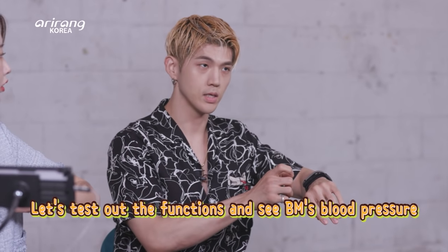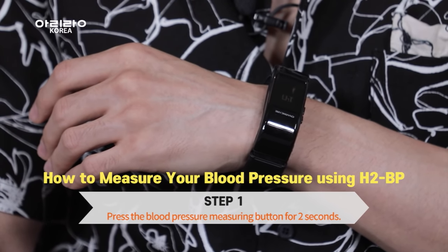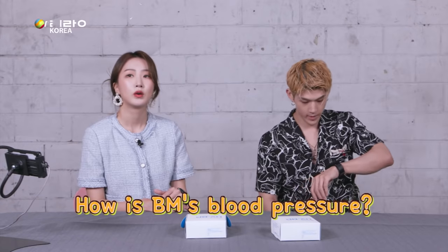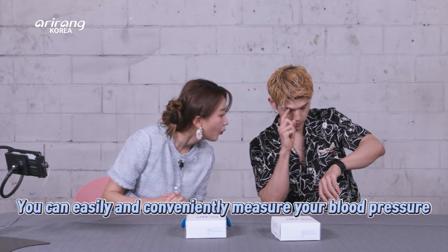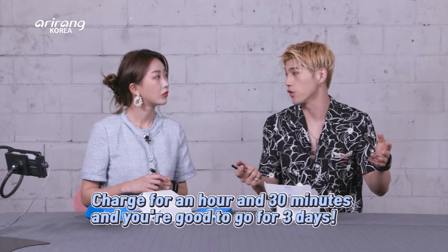I'm going to go ahead and try it now — I'm going to test its functions and we're going to see what my blood pressure looks like. So it's up at my chest and then I press the button. Right now it's 119 over 90, and 50 heartbeats per minute. It's feather light — it's only 43 grams. You can use it for up to three days after charging it for only an hour and 30 minutes. Oh, long battery life!